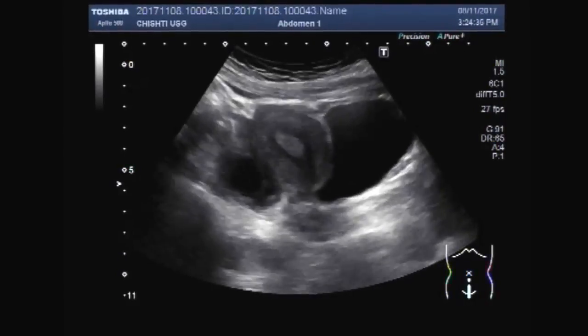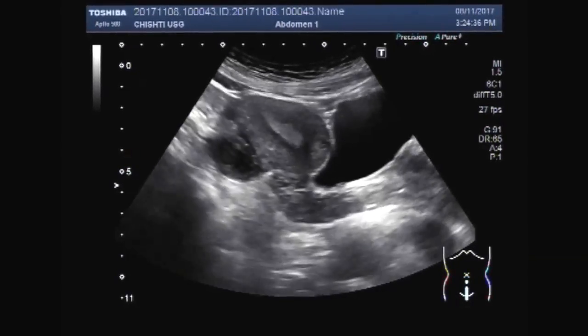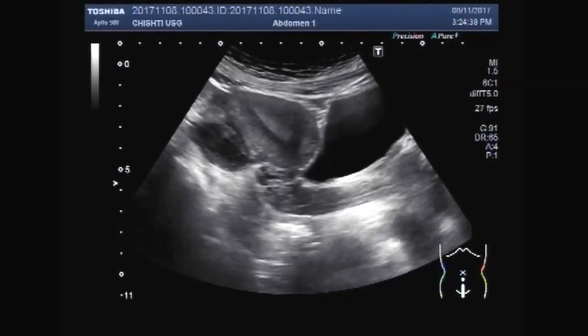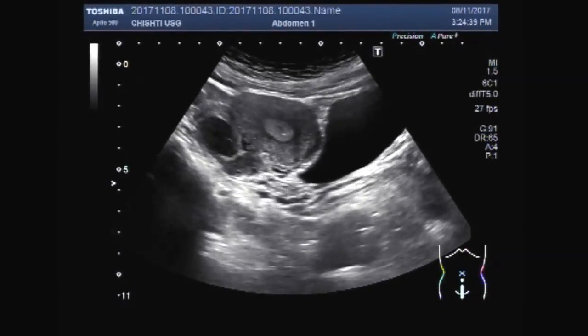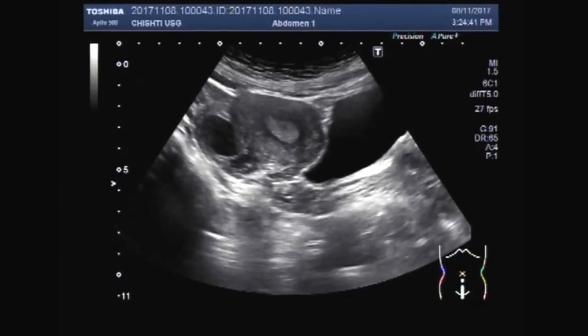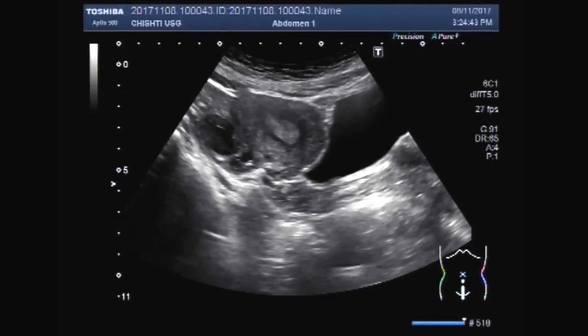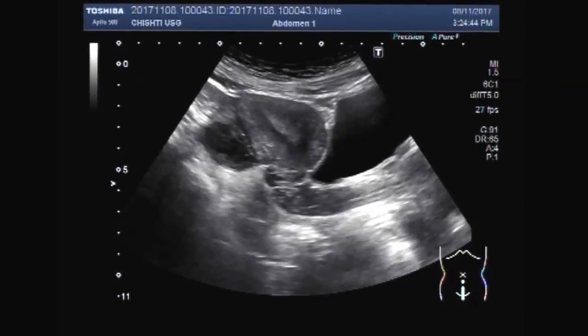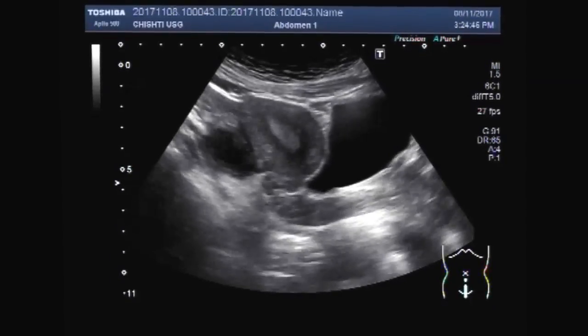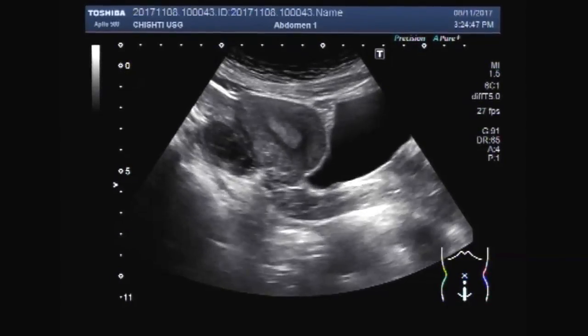This is the uterus, urinary bladder, and left ovary having a small hemorrhagic cyst.